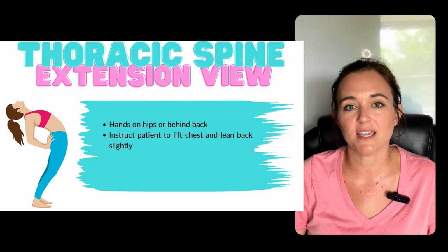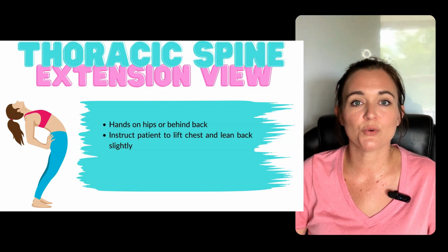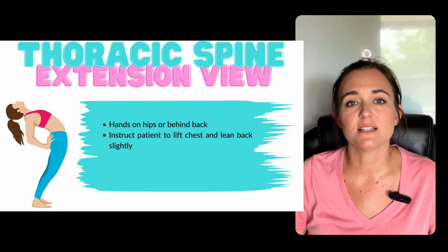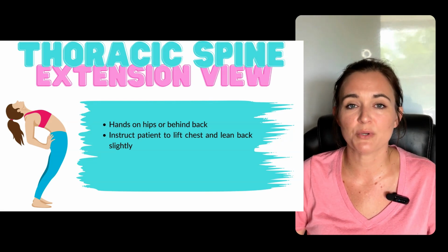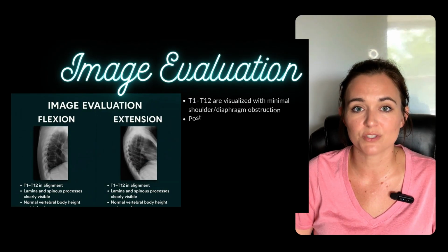It helps to say, lift your chest up and out, or open your chest toward the ceiling. Be close by in case they lose balance. It doesn't take much. Take your exposure once they're stable. Here's the anatomy to visualize in both views.